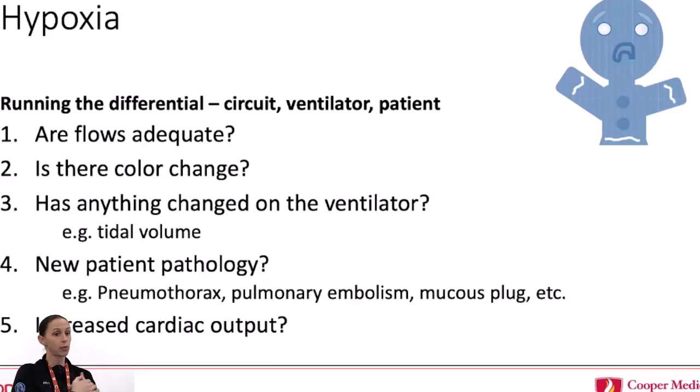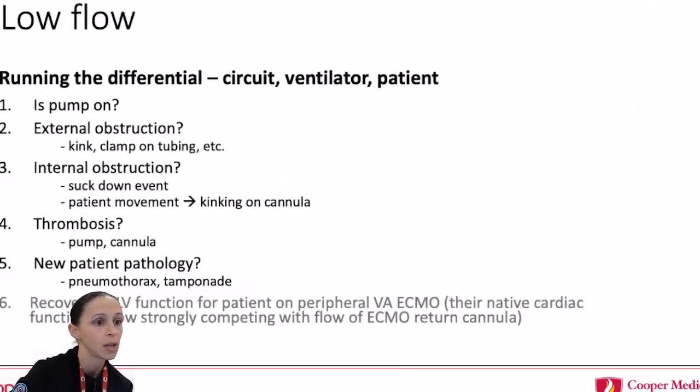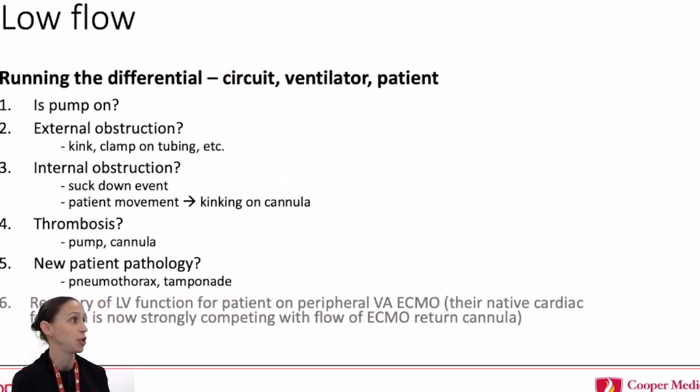And then the recirculation issue also comes up as a separate issue, where that's more of an issue with position and just sucking back that oxygenated blood that we're trying to infuse into the patient. So low flow, think about what can cause that. Is the pump on? Do you have power? What are your RPMs? And is there something increasing the resistance? So if you've got high RPMs, but yet you're still not having flow, there's got to be obstruction somewhere.